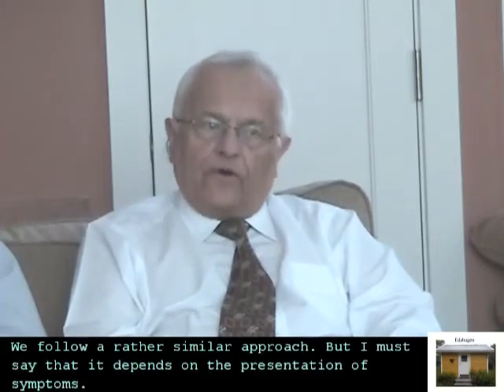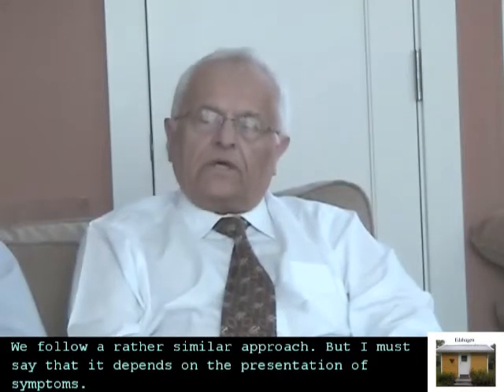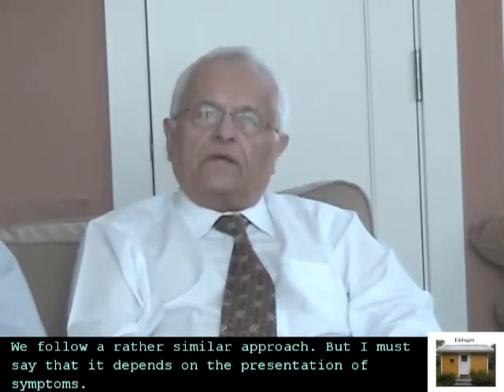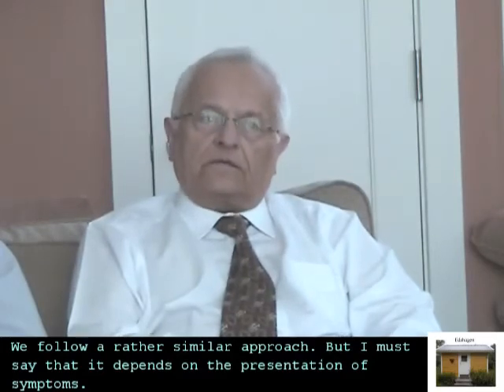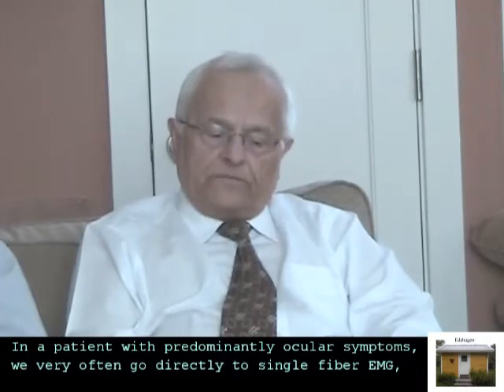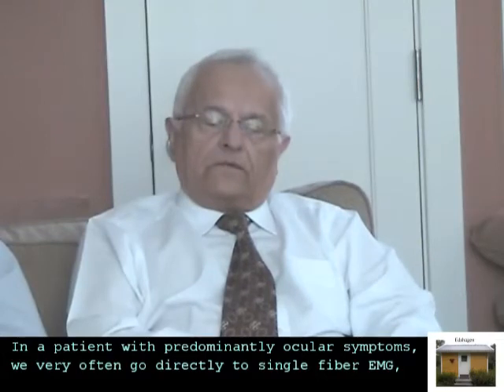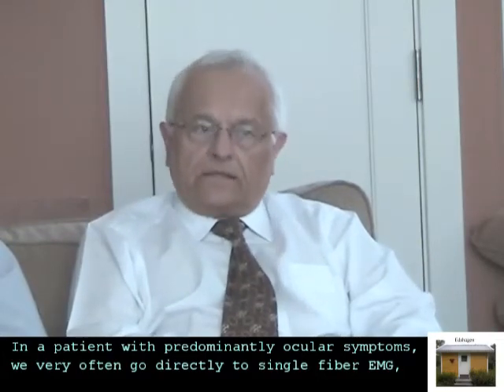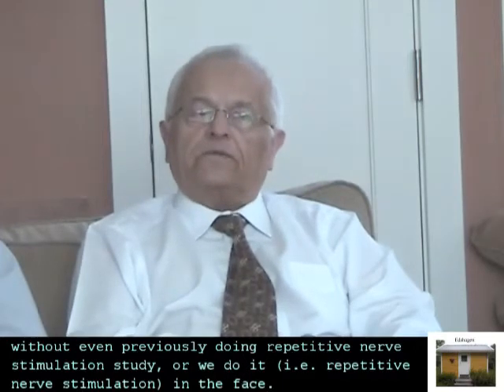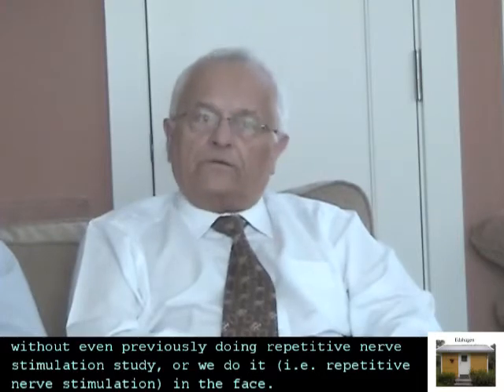We would follow a rather similar approach, but I must say that it depends on the presentation of symptoms. In a patient with predominantly ocular symptoms, we very often go directly to single fiber EMG without even previously doing a repetitive nerve stimulation study, or we do it in the face.